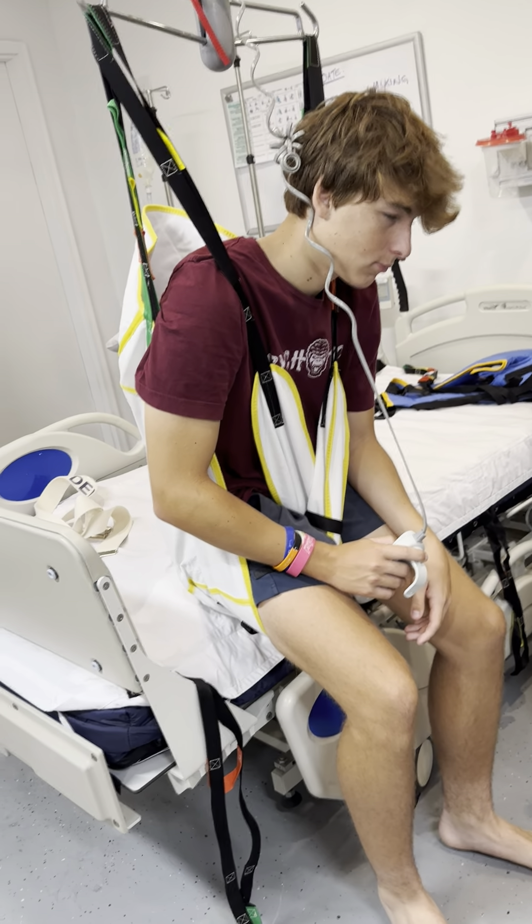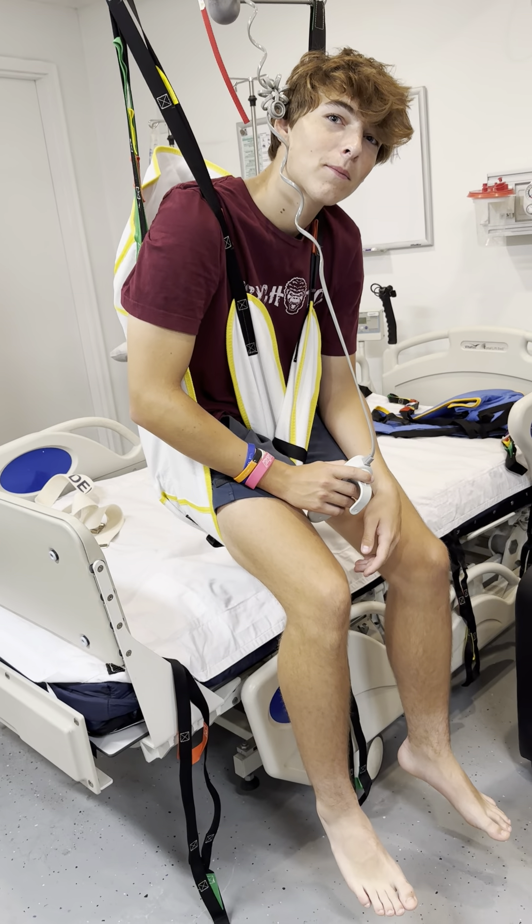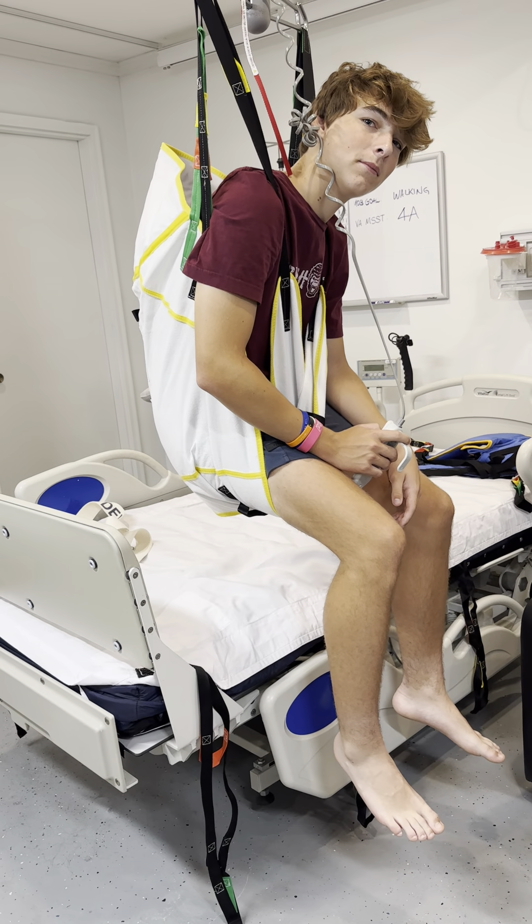Stand. Stand up. You're not gonna stand like that. It's already up though. How much higher can it go? Two inches.